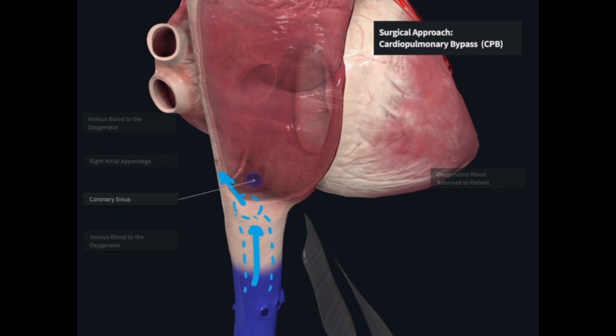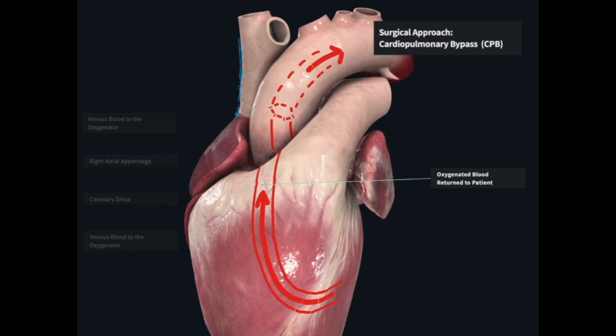After cannulation and confirmation of adequate systemic anticoagulation, the patient is now ready for transition to cardiopulmonary bypass. The surgeon at this point can perform her surgical incision into the heart, such as an aortotomy, for the purpose of a surgical aortic valve replacement and operate in a bloodless field.